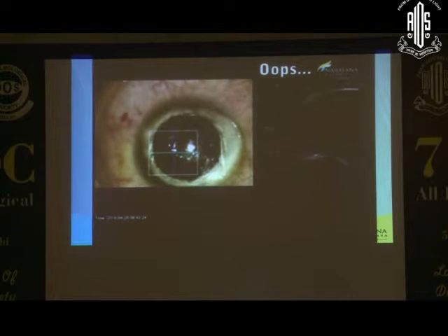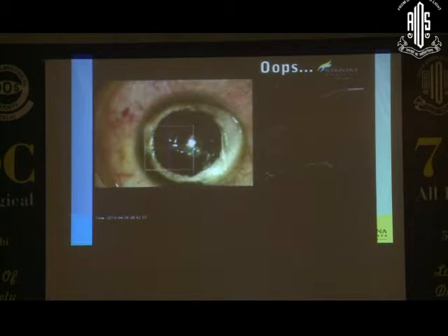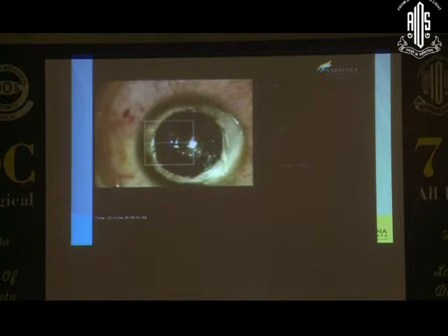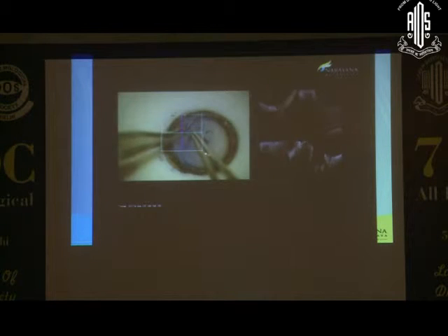very carefully, but then just see there's a perforation at the site of the presence of the scar there, right, which is very easily visible in the OCT. And see how the space swells up. Now we are left with a dilemma as to whether to continue with the DALK or convert it to a full thickness. But we prefer to proceed with the anterolamellar keratoplasty.